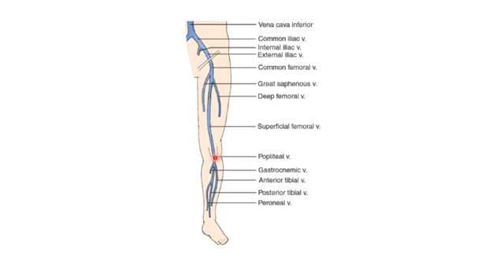Now the popliteal vein courses up along the thigh, and that's where it's called the superficial femoral vein, and it's an unfortunate term. The term seems to indicate that this is a superficial vein. No, it's not. It's actually a deep vein. So a lot of people have now just started calling this the femoral vein. The popliteal vein forms the femoral vein in the thigh, and then it's joined by the deep femoral vein, and that is joined by the great saphenous vein to form the common femoral vein.